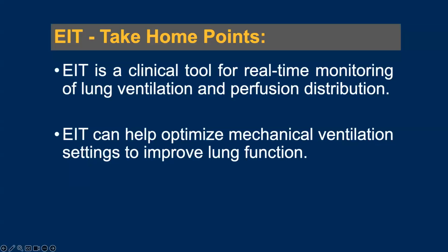So, take-home points. We believe that EIT is a clinical tool for real-time monitoring of lung ventilation and perfusion distribution. We can use EIT to understand the disease, to understand better why our patient is not oxygenating, while combining ventilation and perfusion, understanding the regional ventilation distribution, differentiating the disease as focal or non-focal.